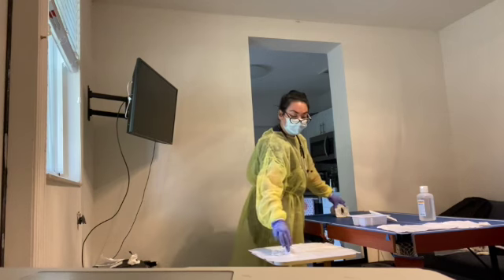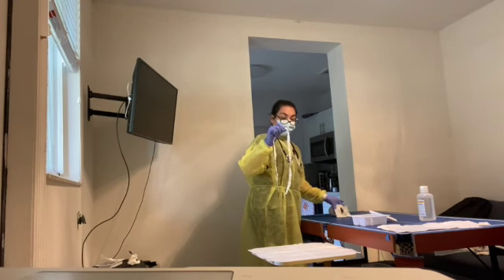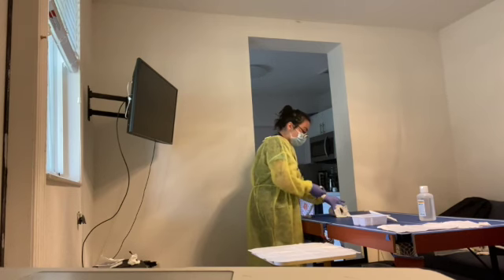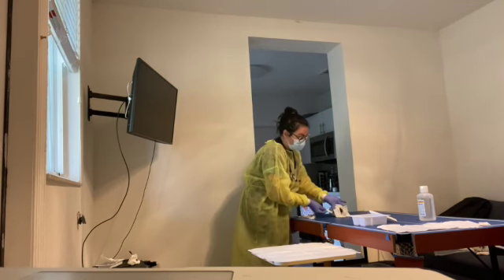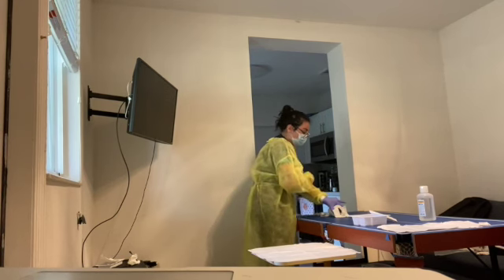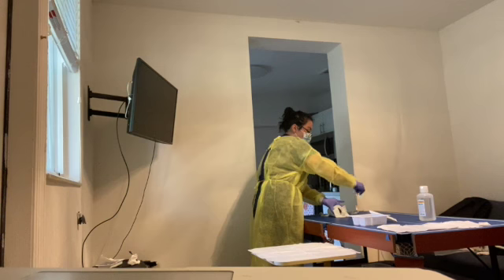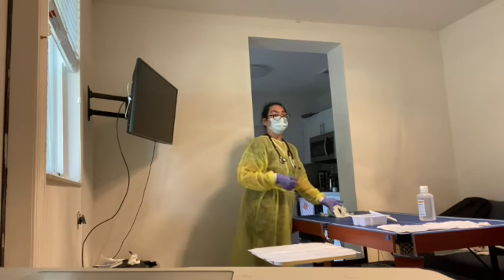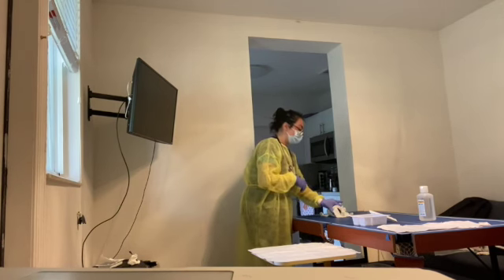And at this time, I'm going to grab the string with my dominant hand. While still having the old string on the patient, I'm going to loop the new string and make sure that I put a loose knot. That's something that's not going to be very hard for the next person to take off in case of any emergencies. I'm going to allow the patient about 1 to 2 fingers of space when moving around. And then I will also, while still having the old string attached, put the new string. Make sure it's not a super tight knot. It's a loose knot that's easy to take off.